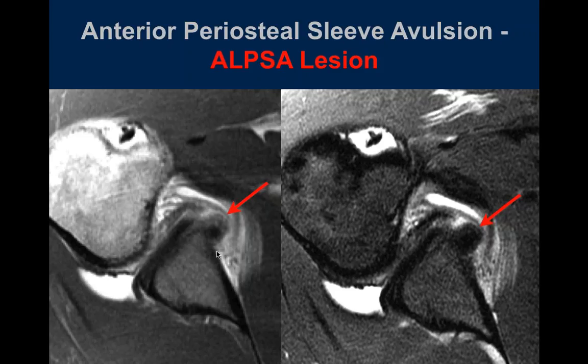Capsule posteriorly, I think that's the inferior part of the inferior glenohumeral ligament. Right. How lax it is. So this shoulder is pretty lax all over, I think. Right. There is really no posterior labrum if you look at it. It's pretty blunt back here.